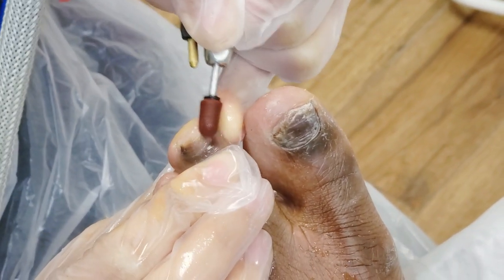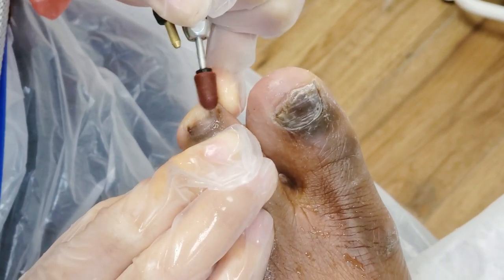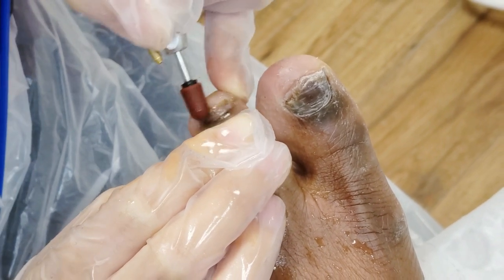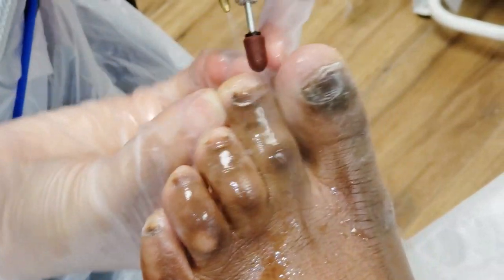You feeling okay? This one might be a little bit tender because some of the nail bed is missing. Have you been cutting your nails back? I've been trying to cut it. Probably not the best thing because it exposes and damages the nail bed.